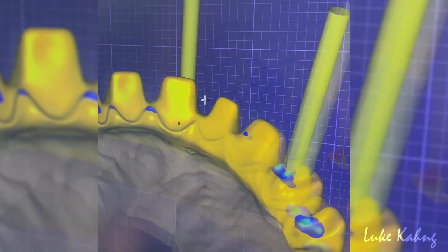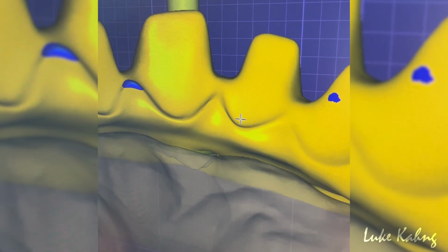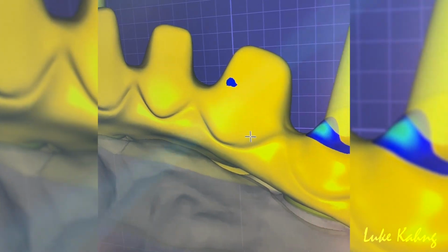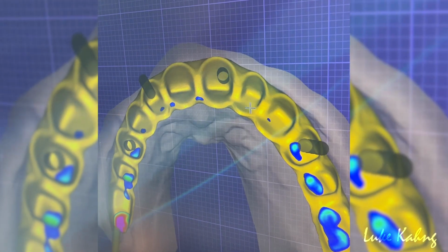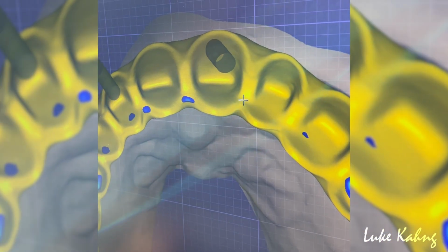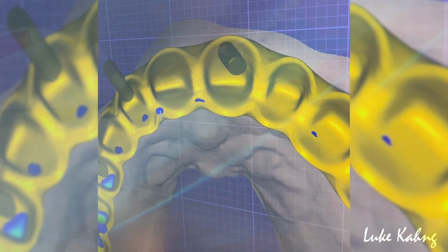So in order to make the single individual, I have to bring the gingiva margin line down more lingually. And then my crown gets support. The other part is that 7 and 9 are displaced facially, so we're going to make another single piece. The doctor is going to temporarily cement 7 and 9 as well. And our frame will be 4.